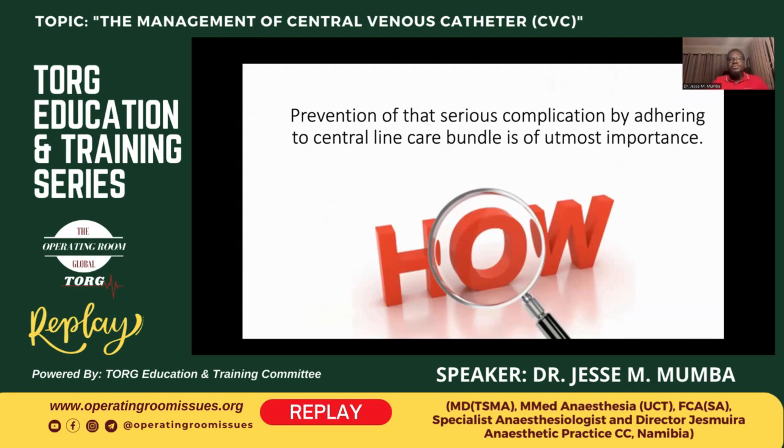So then how do we prevent this complication? It is simply by adhering to what we refer to as care bundles. And these are of utmost importance. It's quite disheartening when you go into an ICU or a patient comes to theater and you find the central line dressing is soiled, the ports are not cleaned, sometimes even open, just clipped off. When I see such things, I actually want to find out who's looking after that patient, because then they need a bit more education on how serious central line infections can be.